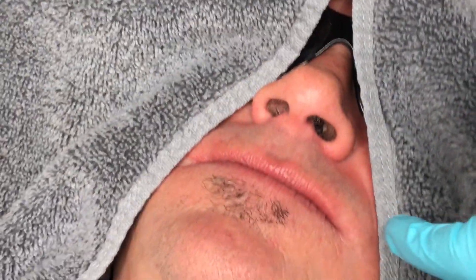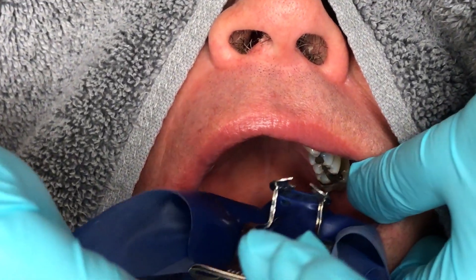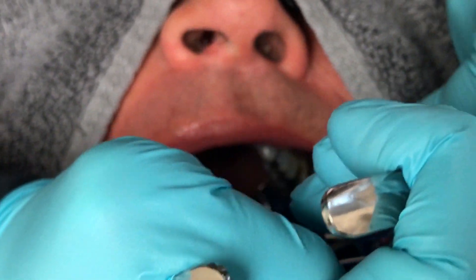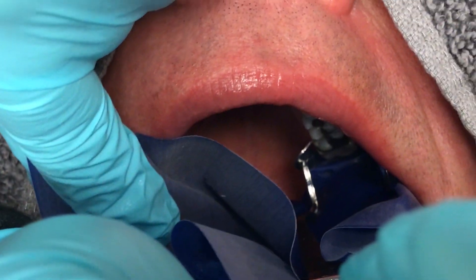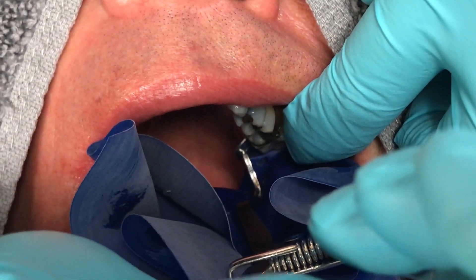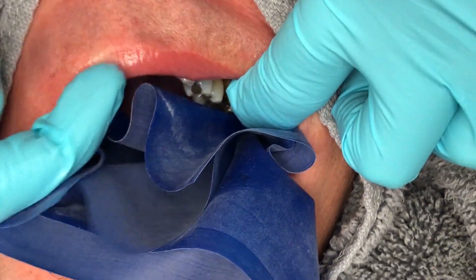Once the contacts have been optimized, I grab the clamp with the dental dam forceps, with the dam draped behind the clamp. With the patient opened wide, I place the clamp on the farthest molar back and release it from the forceps. To secure the clamp fully, I place pressure on both jaws of the clamp, pushing it down apically to ensure the clamp does not come off.